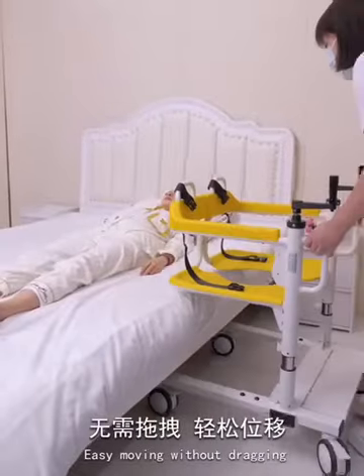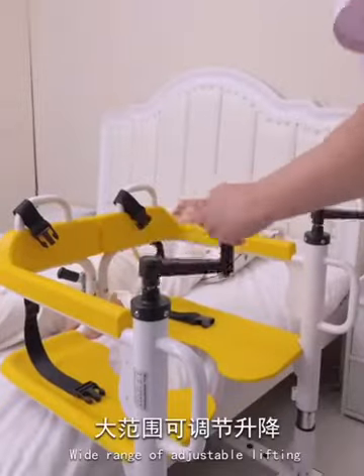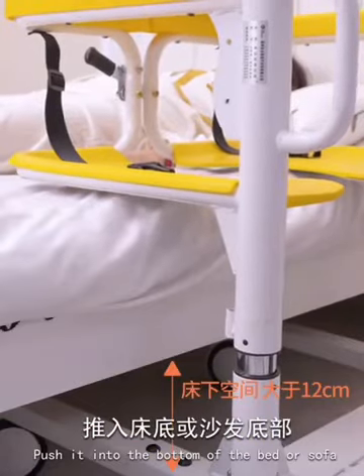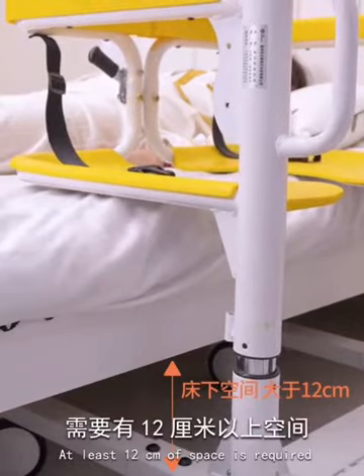Easy moving without dragging. Wide range of adjustable lifting. Push it into the bottom of the bed or sofa — at least 12 cm of space is required.